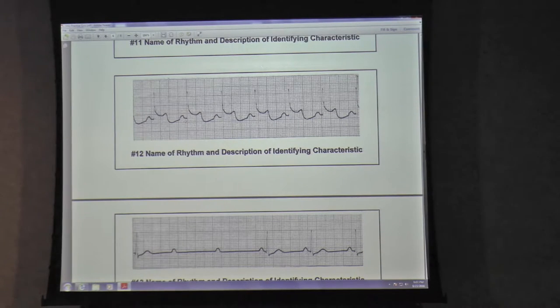Okay, here's another guy that looks like he's got some ST elevation, but let's go through it. So we got a P wave, we have a narrow QRS. I know that it didn't print very well. That's a lot of times what happens when it falls on a solid line. It's a little hard to see sometimes. We got a P wave, narrow QRS, T wave, P wave, narrow QRS, T wave. So the P to R interval is getting towards long, but not terribly long. I'd say it's still probably within that range. It might just be on the borderline.